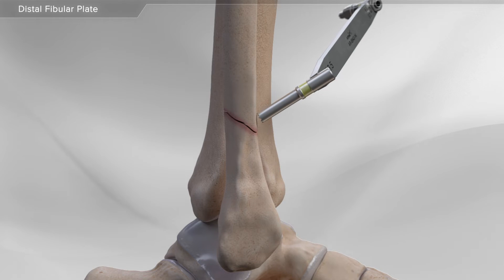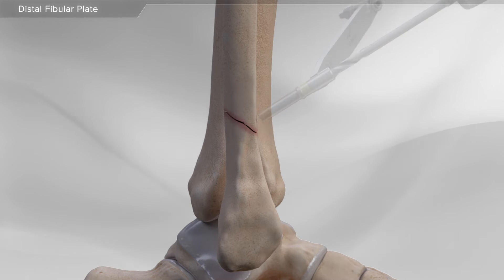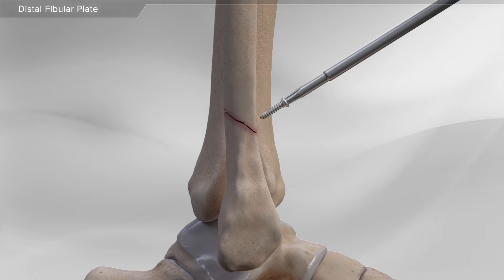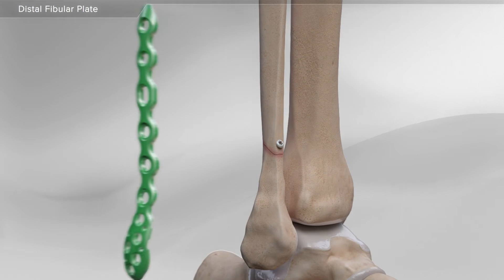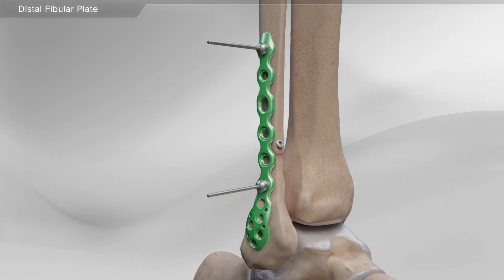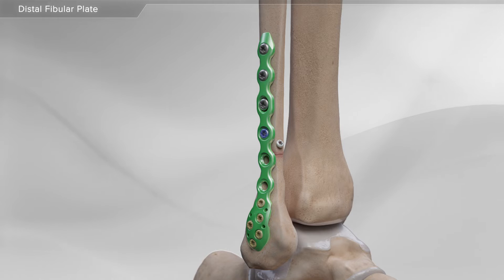Using special instruments, a hole is drilled in the bone, and a screw is used to hold the fracture in the correct position. Next, the distal fibula plate is placed onto the bone and held with two pins. Then, using special instruments, screws are inserted through the plate to hold it onto the bone.